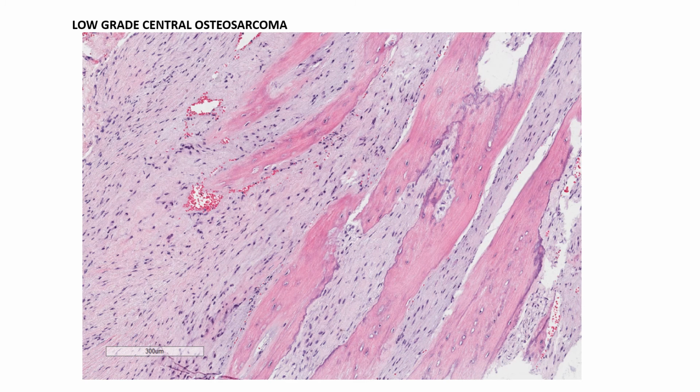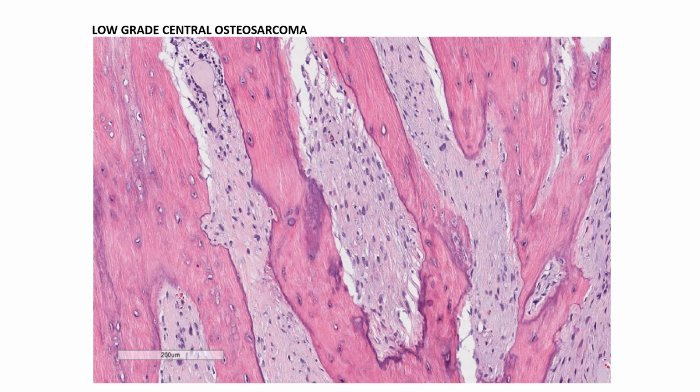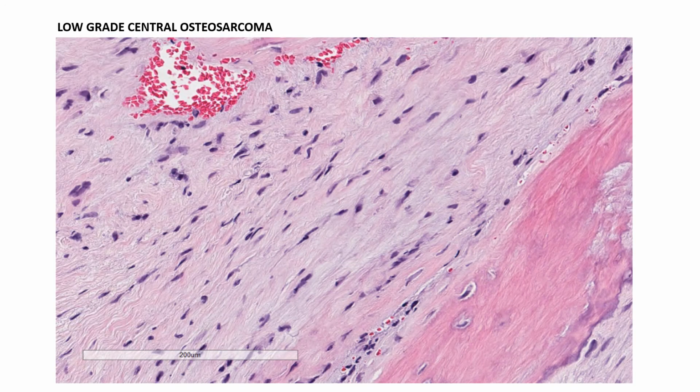This histopathology H&E slide shows low-grade central osteosarcoma composed of fascicles of spindle cells with mild cellular atypia arranged in interlacing bundles that permeate pre-existing bony trabeculae and medullary cavity. This H&E slide shows variable amount of osteoid production, which may present in irregular, branching and curved woven bone trabeculae. And this higher power view shows spindle cell component with at least moderate nuclear atypia and variable nuclear size.